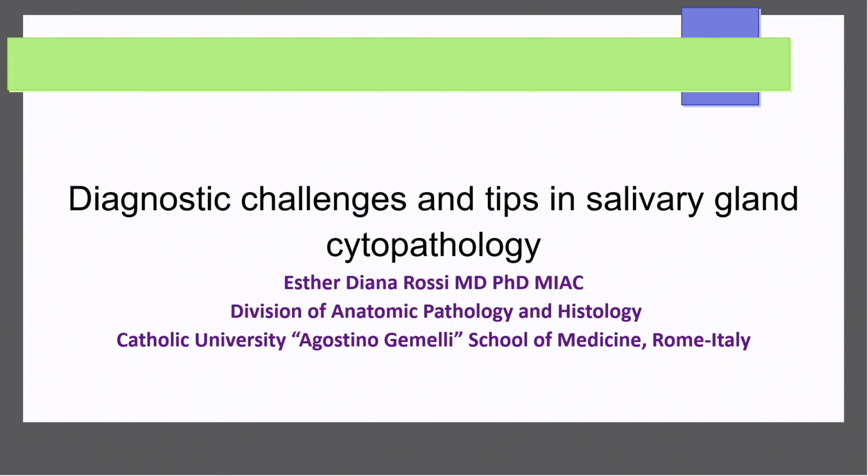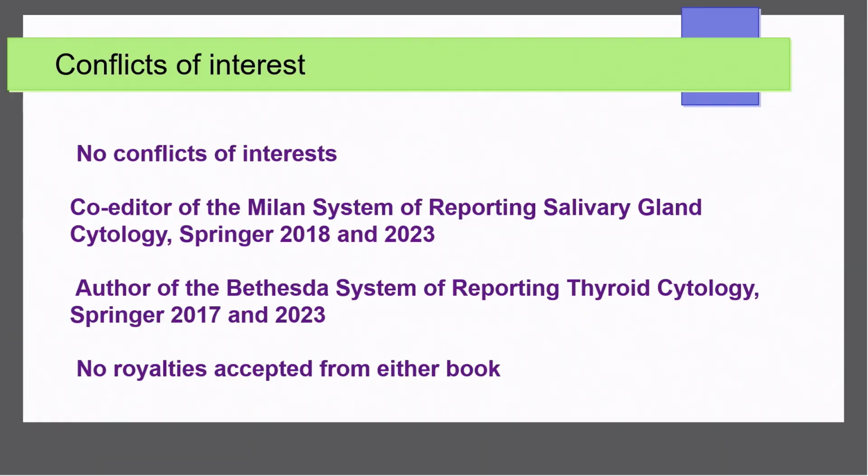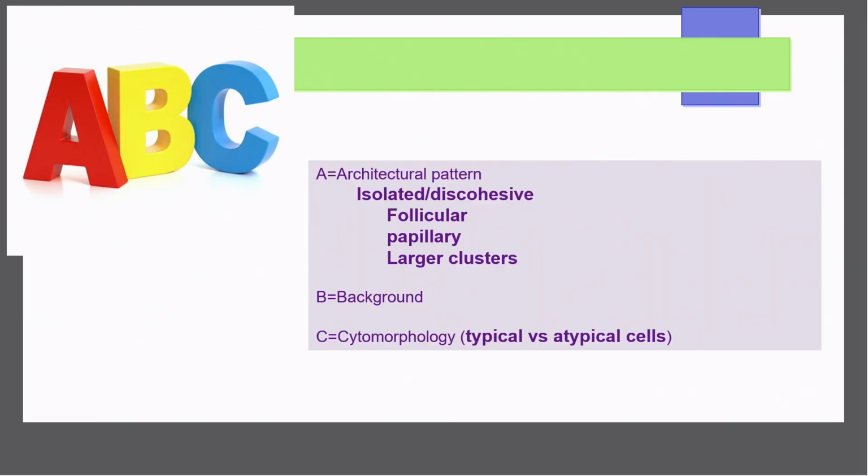Let's move on to this talk about salivary gland cytology and the diagnostic challenges and tips. No conflict of interest. For the basics, we have to define the ABC of salivary cytology: architectural pattern, the background, and of course the cytomorphology.